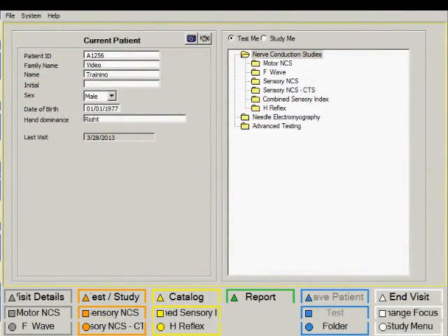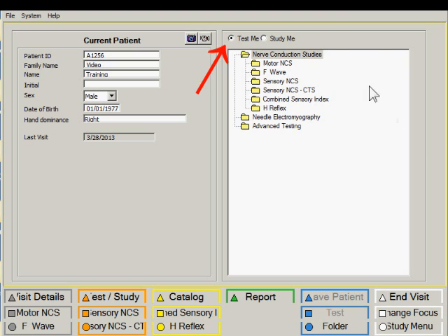The electrodiagnostic test procedures can be organized in two different ways. One method is by using the so-called test folders. Here we are looking at a test folder containing nerve conduction studies.